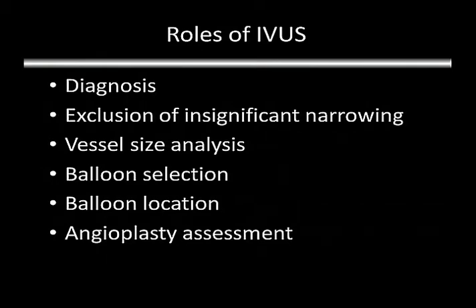The other roles for IVUS in treatment, well, I'll start with the first one. I've had a patient who went to India for their procedure, had the first injection, showed a high-grade stenosis, and then the patient had an anaphylactic reaction, complete vasomotor collapse, resuscitation, survived, and went home knowing they had a stenosis but were untreated. And no one was really willing to give that a second chance.